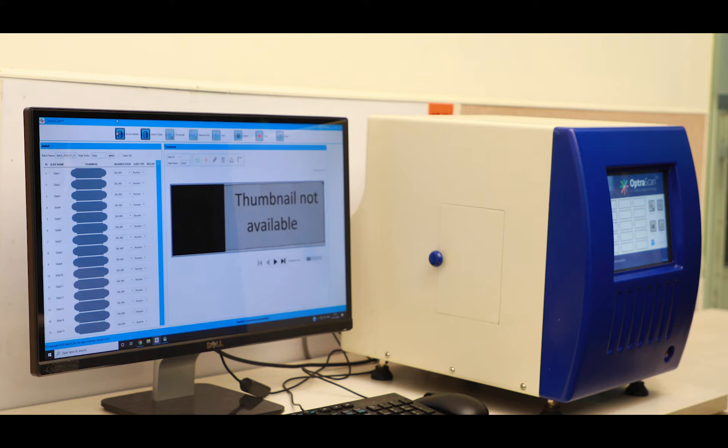The unit you see here is our OS-15 HD scanner, which has a carrying capacity of 15 slides and can scan your pathology glass slides at a 40x magnification.